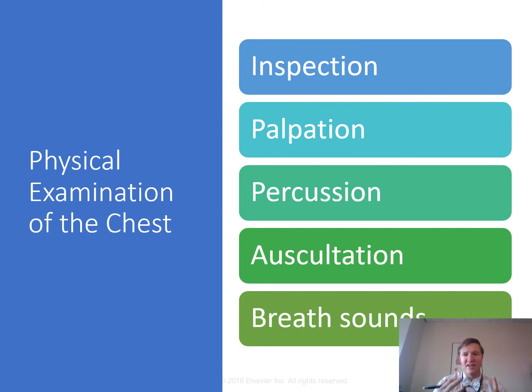You have less surface area. You have lower lung compliance. So the problem should be corrected. I remember going into a patient's room and his lung compliance was low, his airway pressures were high, obviously, and his oxygenation was low, and they're like, hey, go do something, right? So I go in there and I'm listening to his lungs, very distant, diminished breath sounds, and I palpate his abdomen. Sure enough, it is hard, it is rock, it is full of fluid. So he had really bad ascites and it was restricting his ability to breathe and was back pressuring the ventilator.